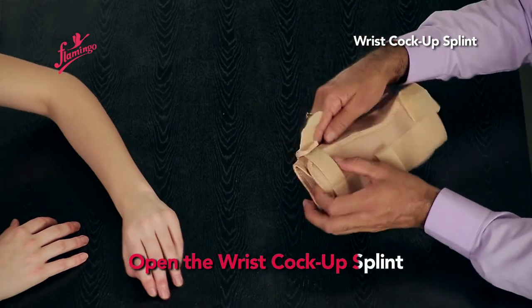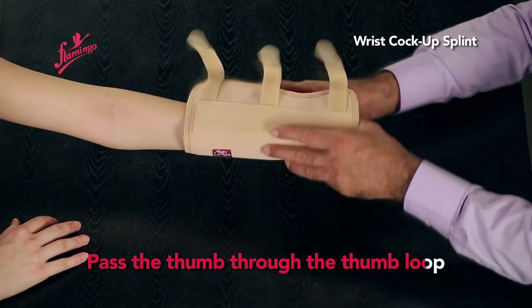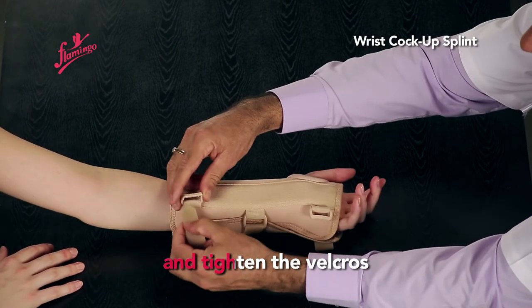Open the wrist cock-up splint. Pass the thumb through the thumb loop and position the splint in the center of the palm side of the hand. Then tighten the velcros.